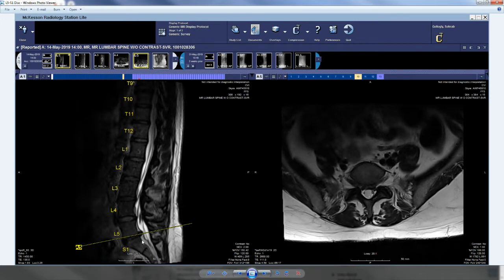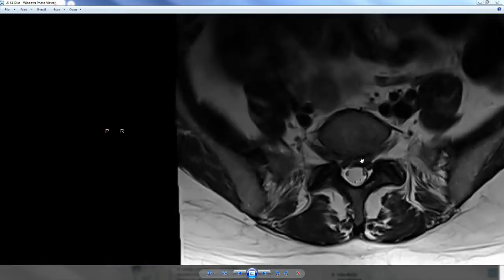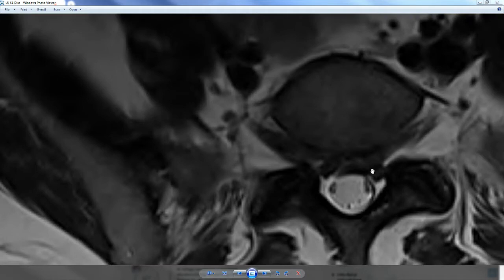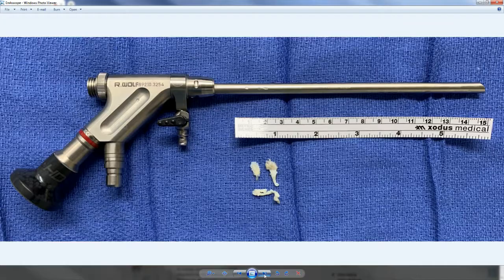This is a patient with an L5-S1 disc herniation. Her symptoms are on the left side. As we zoom in on the left side, you can see the S1 nerve root being displaced by a broad-based disc fragment that appears to be separate from the disc material itself. She has a lot of S1 nerve root pain.